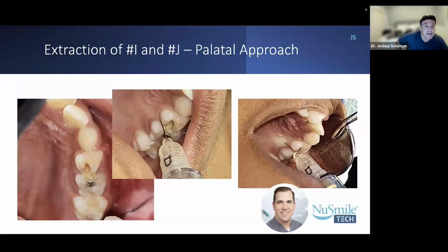I do exactly what Ann does: I step on the pedal ahead of time, I double check that everything's working, and I'll lay that needle slowly as I give that stage 1. But I wouldn't recommend doing this orientation as a newbie. Later on, you may want to think about turning their head and giving it horizontally for that stage 1 and then changing orientation.